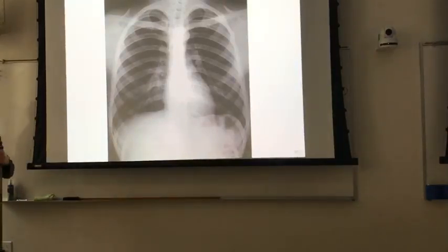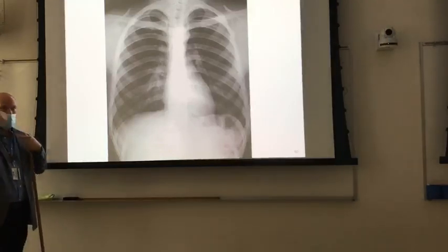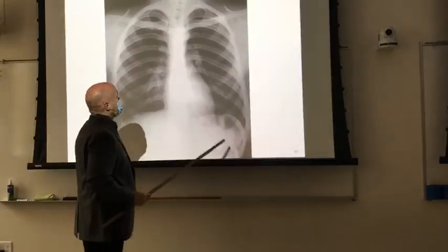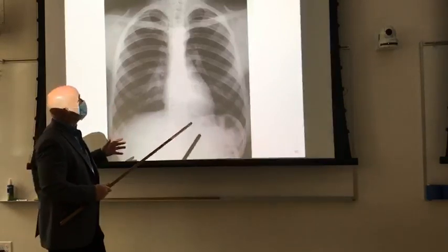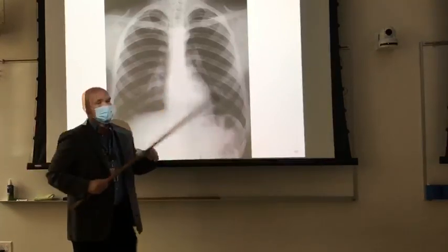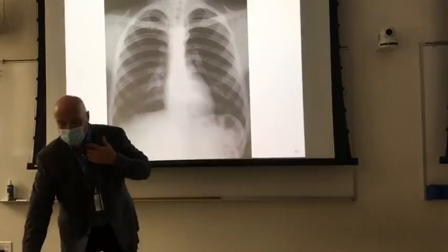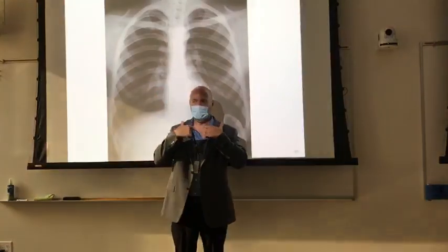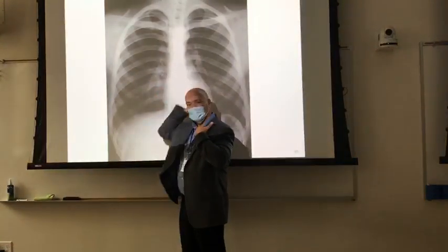It's not, because clavicles are here and the spine's back there, but it kind of looks like it is. So if the patient's rotated, let's say the patient has clavicles here and here, right? Spine's right in the middle. So if I rotate this way, where's my spine going?